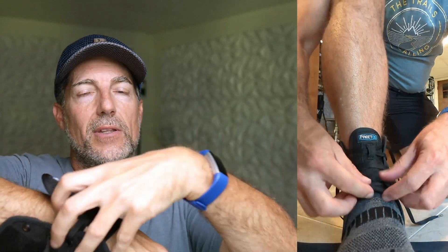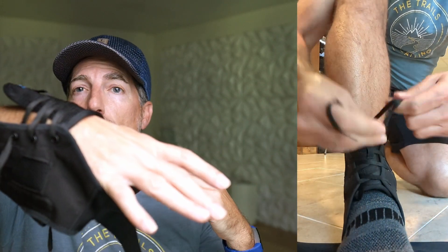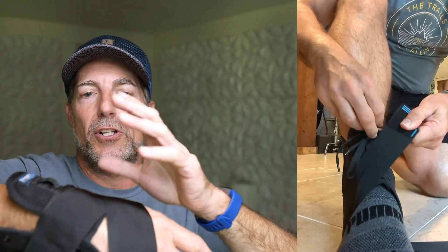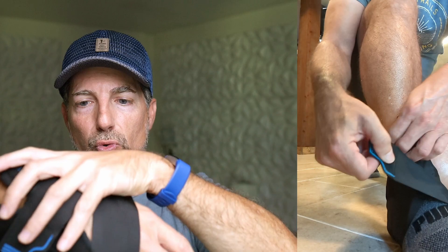Essentially, it's like a shoe. You have a tongue with laces. Drop your ankle into it and lace it up just like you would a shoe. Then you rotate over diagonally, and that will add compression to your ankle.